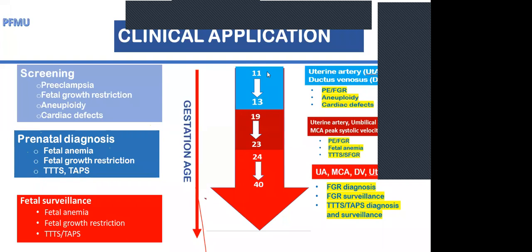On the ductus venosus, I just have one question. You know, the ductus venosus and the inferior vena cava are very close to each other, and you can at times miss the ductus venosus. And apparently the ductus venosus is key in deciding whether to deliver the baby or not. How can we avoid the pitfall of ending up measuring the IVC instead of the DV?